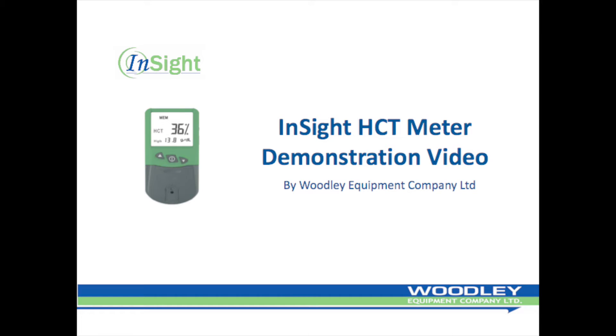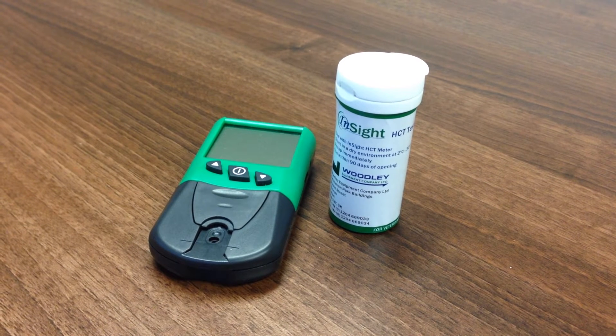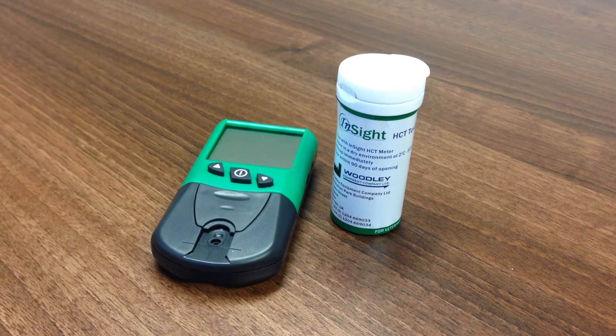Welcome to the Insight HCT instructional video, brought to you by Woodley Equipment Company Limited. The Insight HCT Meter is a low-cost, handheld meter for the measurements of canine and feline hematocrites and total haemoglobin.